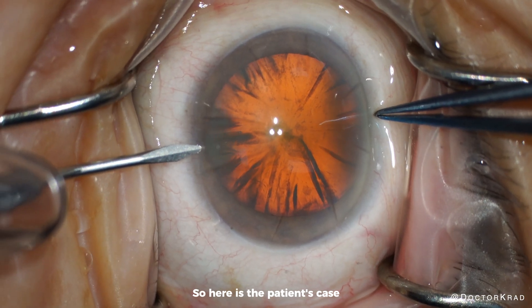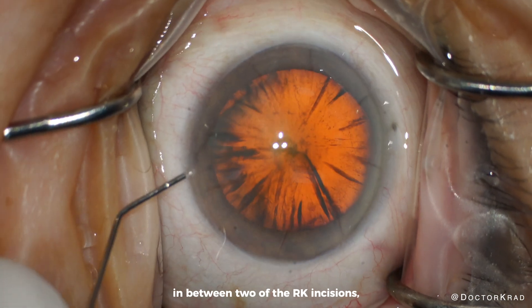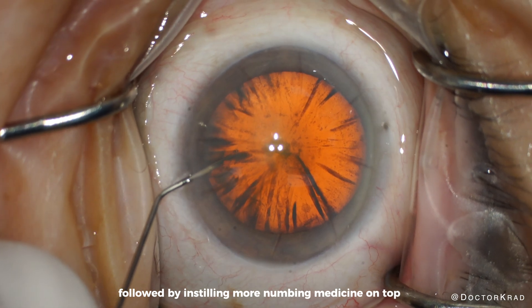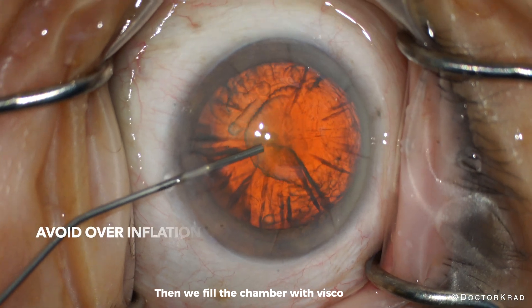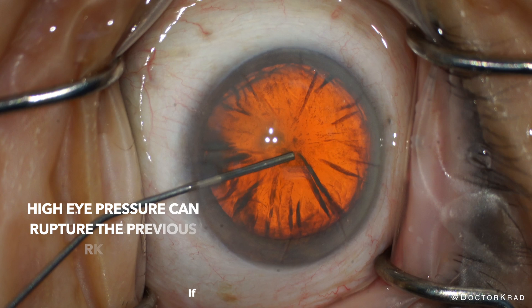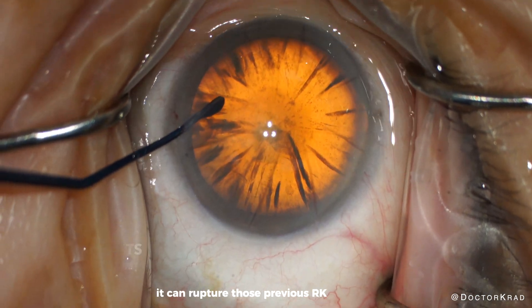So here is the patient's case. We start by creating a paracentesis in between two of the RK incisions, followed by instilling more numbing medicine on top of and inside the eye. Then we fill the chamber with viscoelastic, being careful not to over-inflate the chamber. If the eye pressure is too high, it can rupture those previous RK incisions.